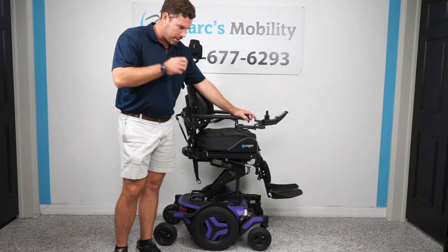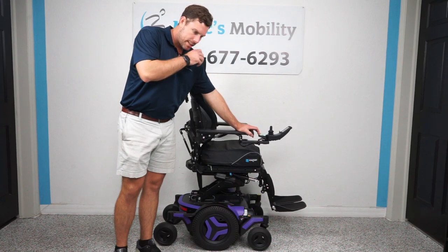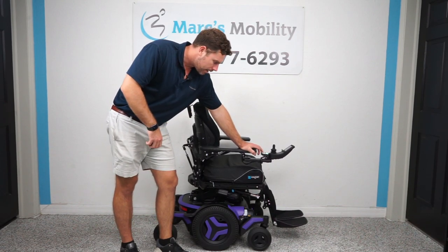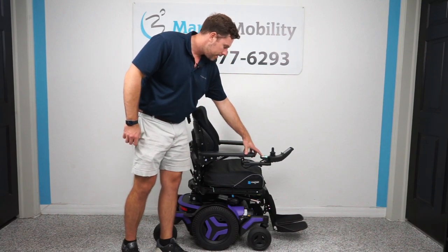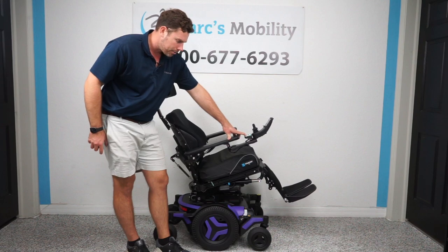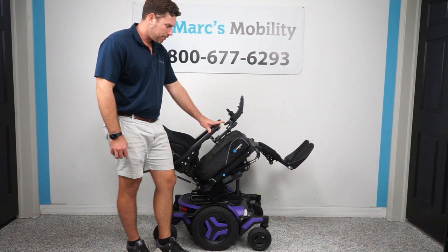The next feature is electric tilt, which is probably the most medically necessary feature on a chair. Tilt feels as if you're sitting in a stationary chair and somebody pulled you backwards — you feel like you're going to tip over, but you're not. What it actually does is create blood flow to your lower half. Gravity takes your weight off your lower half and applies it to your back, creating circulation throughout your legs. If you struggle with pressure sores or need to get your feet above your heart, this is a function you can use.